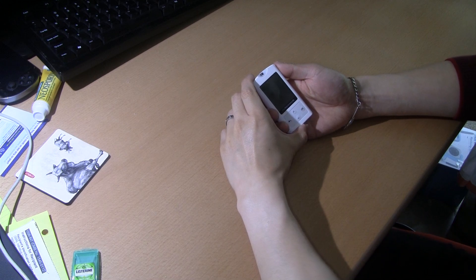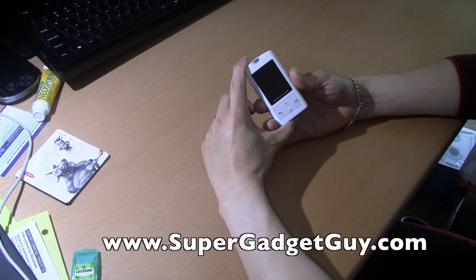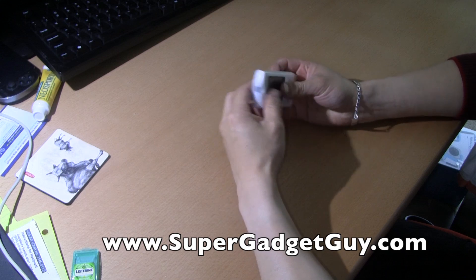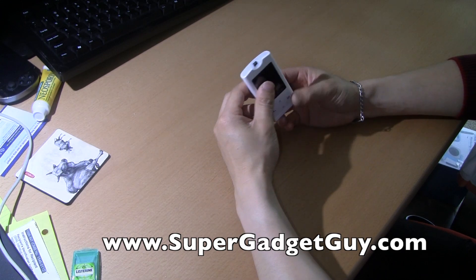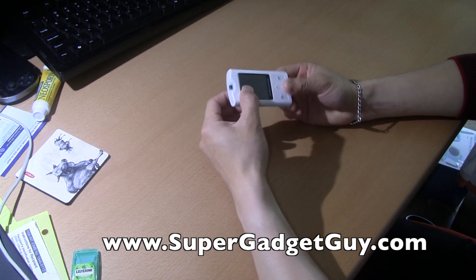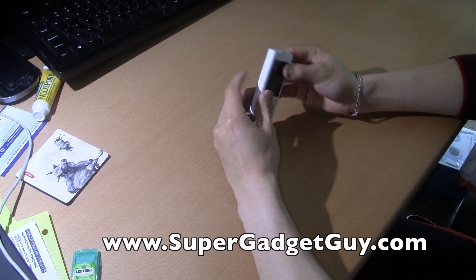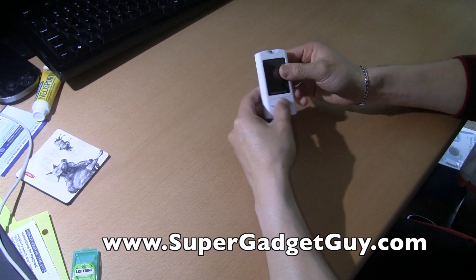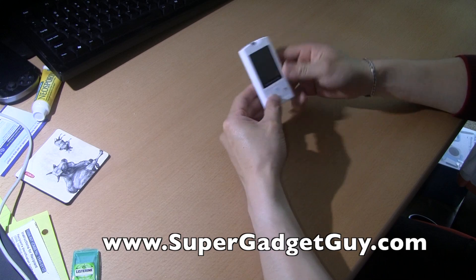Hey guys, SuperGadgetGuy here. Today I'll be doing a review of the OneTouch VarioIQ meter. I'm no longer going to use this meter and I forgot to save the strips, so I can't show you what I mean — because the strip is the only interaction part, in addition to the buttons on the meter.